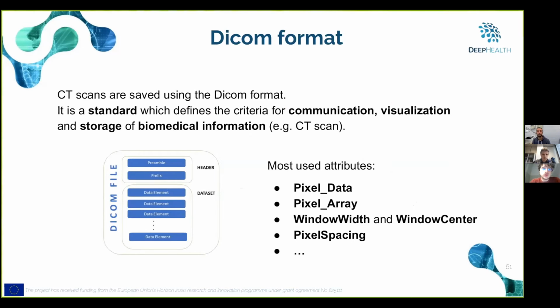The CT scans are saved using the DICOM format, which stands for Digital Imaging and Communication in Medicine. It's a standard which defines the criteria for communication, visualization, and storage of biomedical information, so that the transfer of medical scans between different hospitals, for example, is easier.